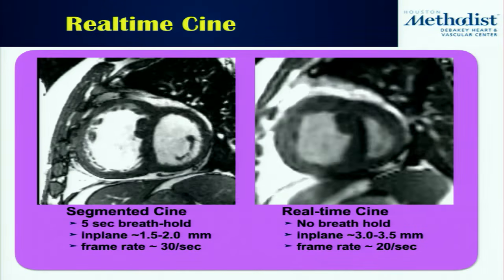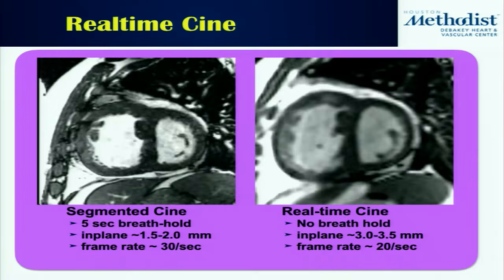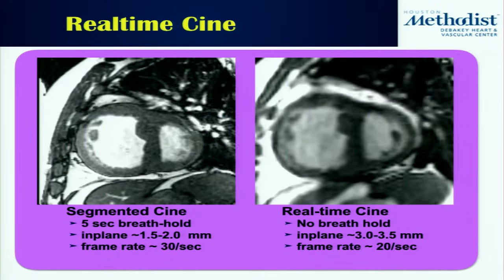Then how many do you actually record? Typically we'll do this for about 5 seconds. Yes, it's a 5-second window. And you'll see a lot of times, especially when there's a lot of RR variability, it doesn't make sense to try to give you volumes and EF quantitatively.